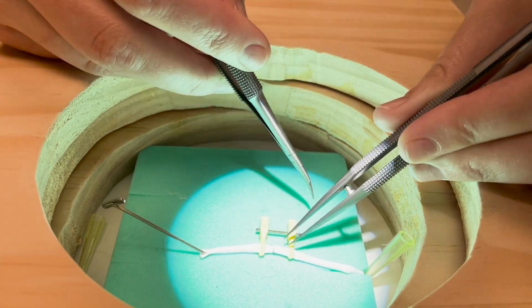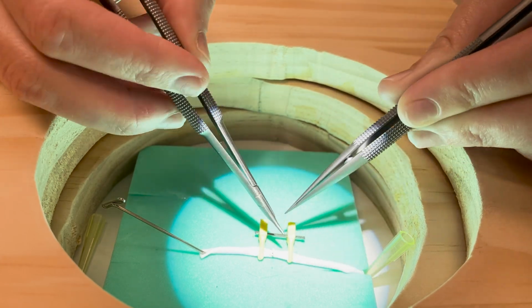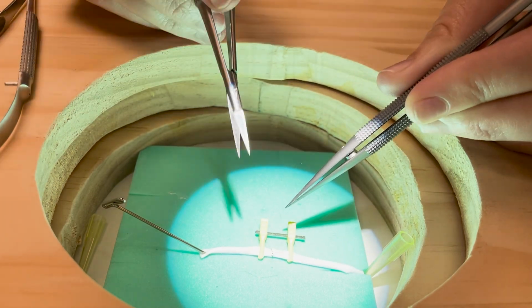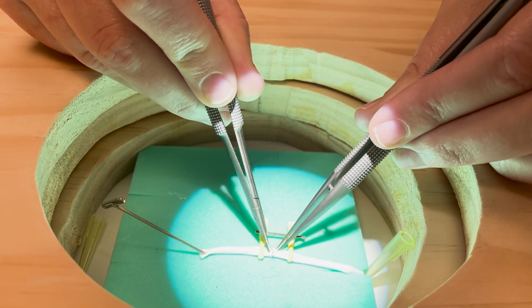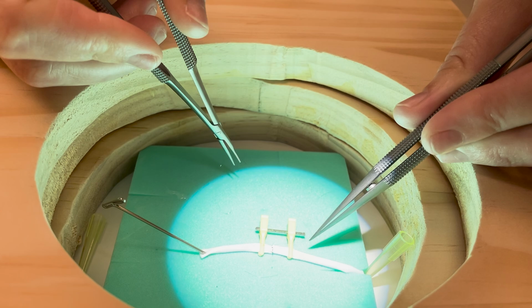The suture is advanced through the vessel wall, setting up the C-loop and suture tail. The C-loop should be 2 to 3 times the length of the suture tail. An ideal length of the suture tail is the distance between the anastomosis and the Acland clamp. The needle driver is used to grasp the C-loop, and the suture is tied with jeweler forceps grasping the suture tail.